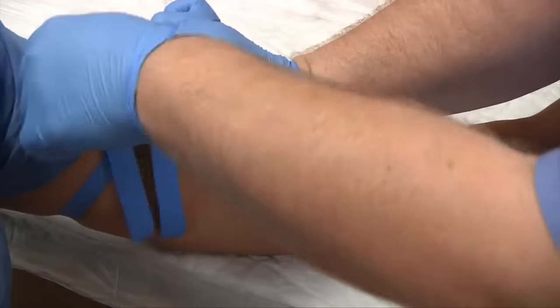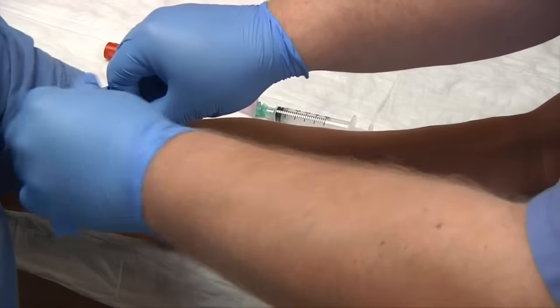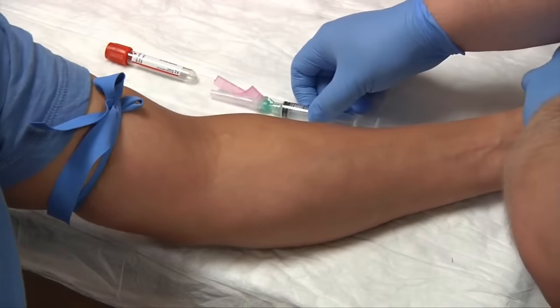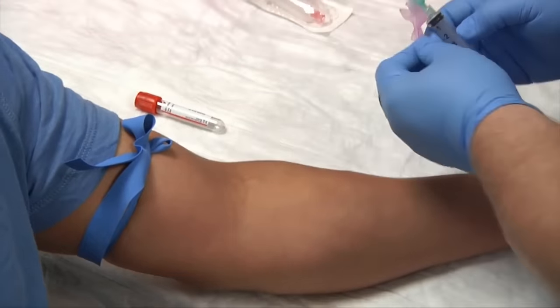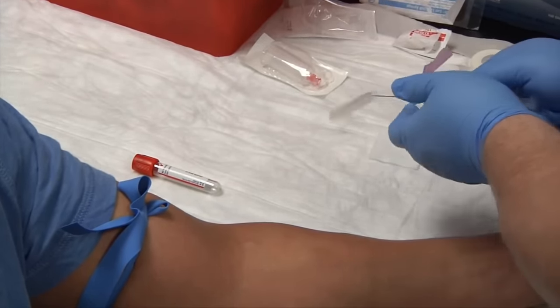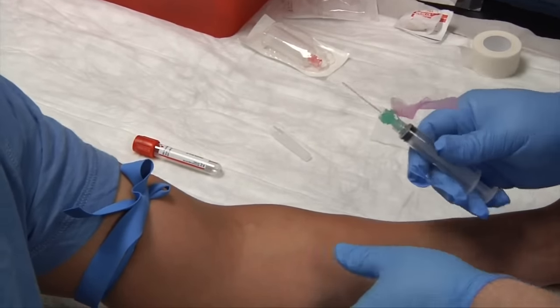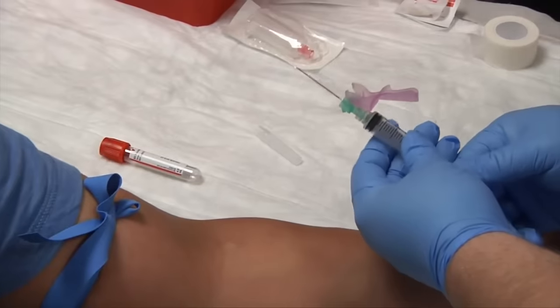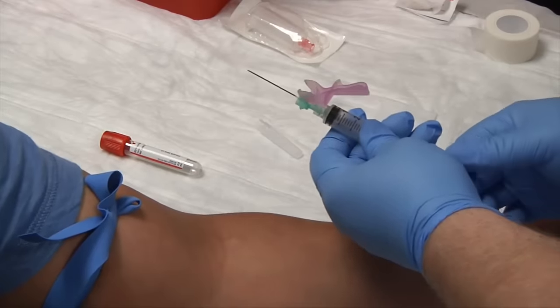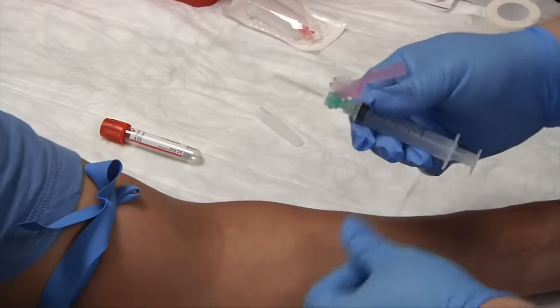Place the tourniquet, making sure that the ends are up. Have the patient make a fist. Pull back the safety cap and release it down. Check the needle and make sure everything is okay with it. Also, with the syringe, before you stick your patient, pull back on the plunger to loosen it — sometimes needles have been sitting for a couple of years, so you just want to loosen the plunger a little bit.